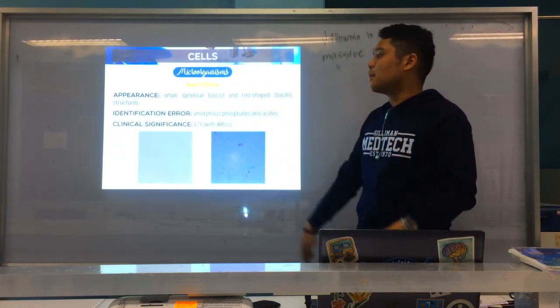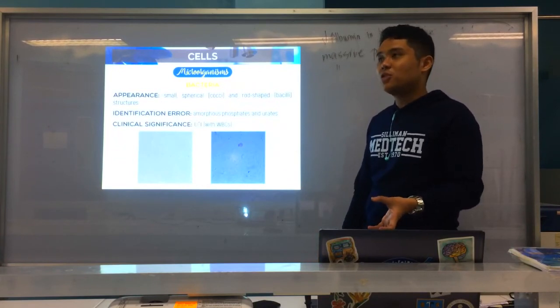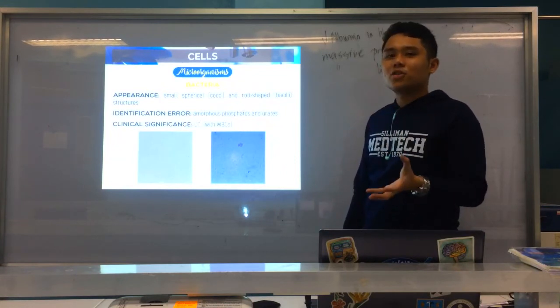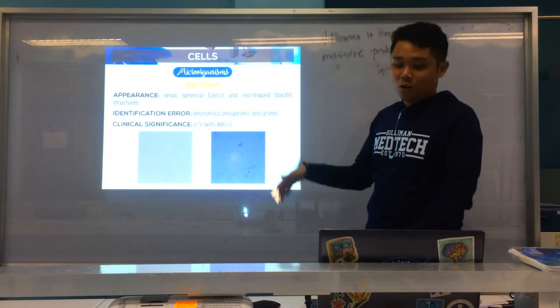Dapat na ay WBCs para makaingon ka na UTI to siya. Kaya na infection. Kaya if wala yung WBCs, usually it could indicate na dugay na ang specimen or dili siya infection or na-contaminated ra siya. Okay? Alright. So again, that's for bacteria. It could be cocci or bacilli.